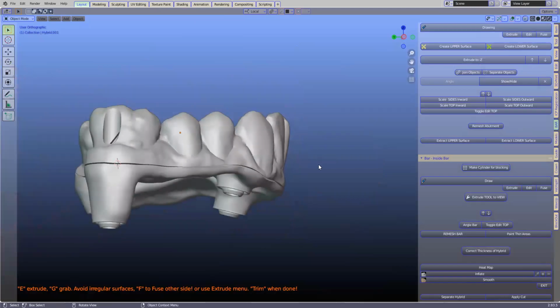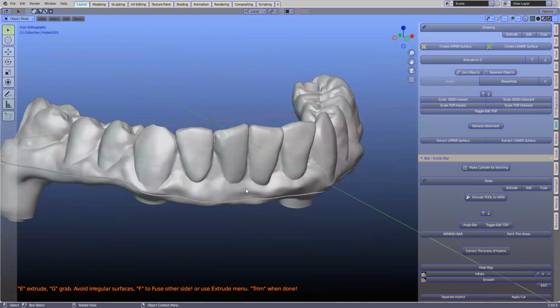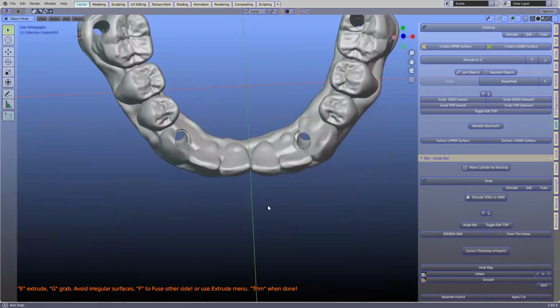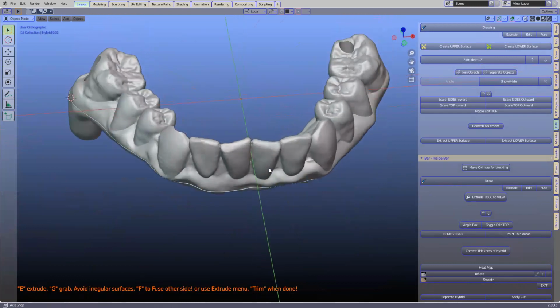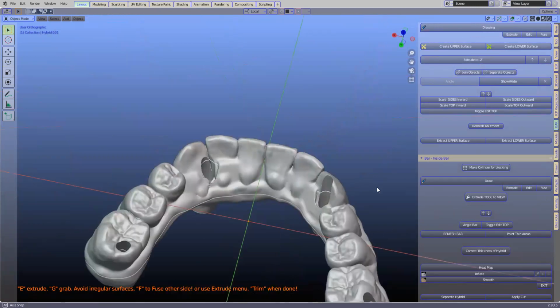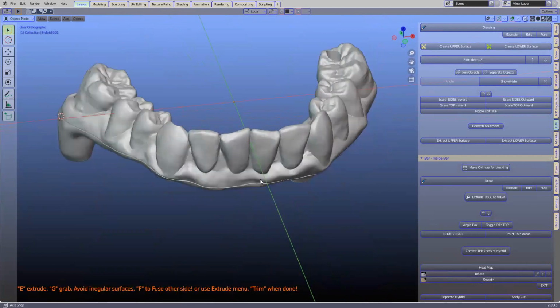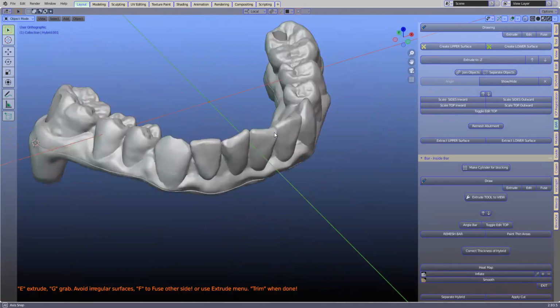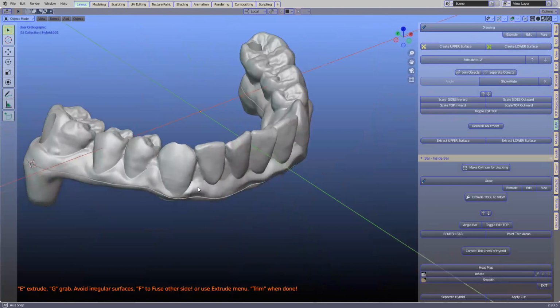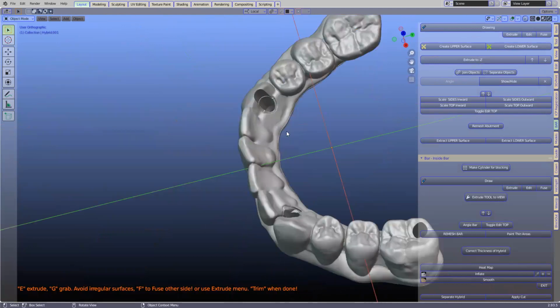So here's a question. We could probably even introduce a screw thread into that, can't we? So if you say, for example, you don't want to glue it on, this patient grinds through these teeth every year or whatever. You don't want to take the whole structure out. So ideally, we want to have a screw thread in there that we can then use to screw this component down. I suppose I haven't thought of that, Wolf.